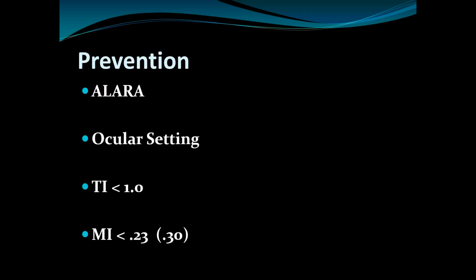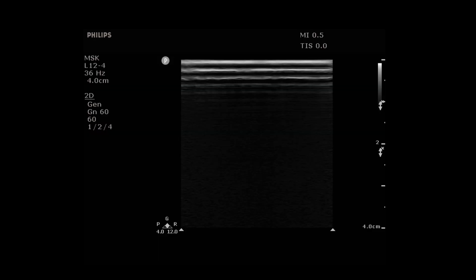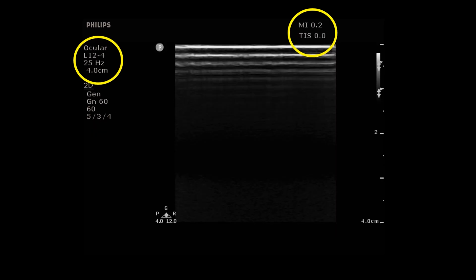So how do we prevent it? Well, of course, we always use as low as reasonably achievable. We want to use the ocular setting, and that's important because of our thermal and our mechanical indices and where they're set. Thermal index needs to be less than 1, mechanical less than 0.23. Now, some sites say 0.30, but we're going to go with 0.23. So you can see if you're using the musculoskeletal setting on your machine, you think, well, I don't have an ocular, I'll just use musculoskeletal. And so our mechanical index, though, is 0.5, which is twice the safe level. So by having an ocular setting, and you can actually make one of these in most of the machines, you'll notice that the mechanical index is down to 0.2, which is a safe level.